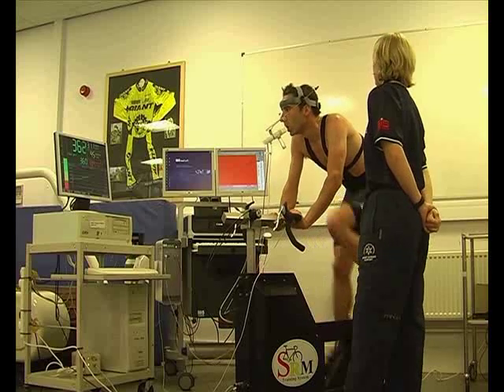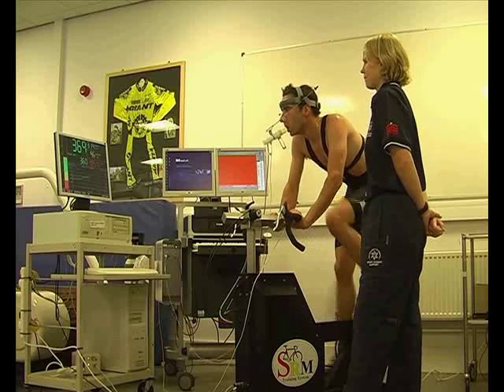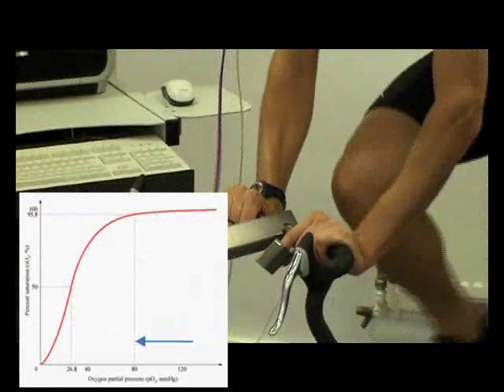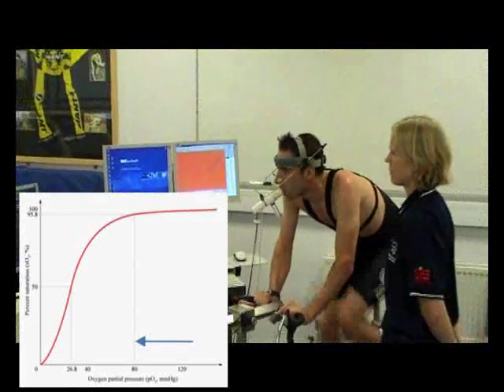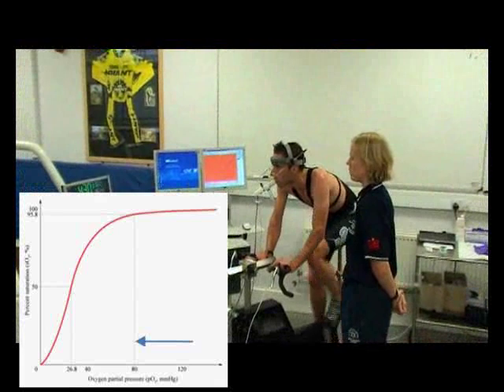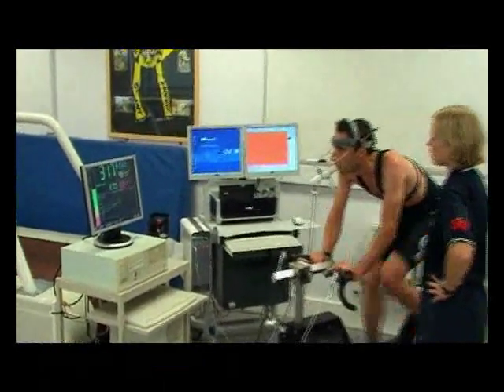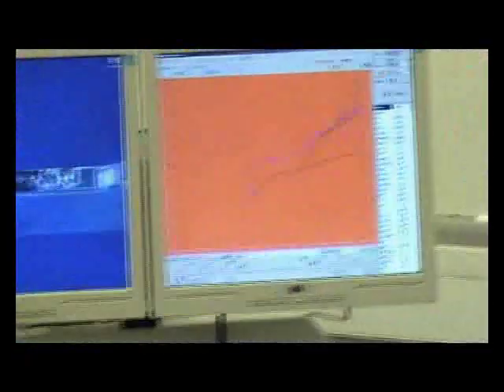By 300 watts, the athlete may find effective ventilation of the lungs challenging. The partial pressure of oxygen reduces and oxygen saturation begins to drop from the 99% saturated value seen at low intensity exercise and rest to lower figures. At 370 watts, the athlete is now using about 4.3 litres of oxygen every minute.